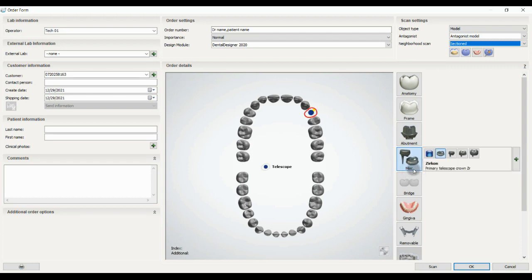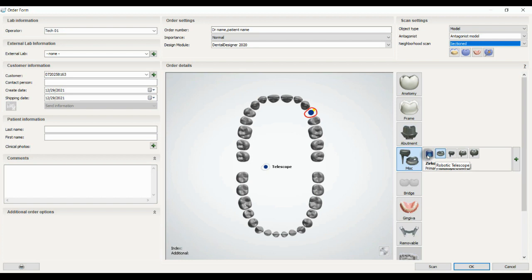Next option is misc, where you can design telescopic and post-anchor for your doctor. The first option is telescopic, robotic telescopic, post-anchors, and different types of post and core, for example anatomical one or the full contour one.